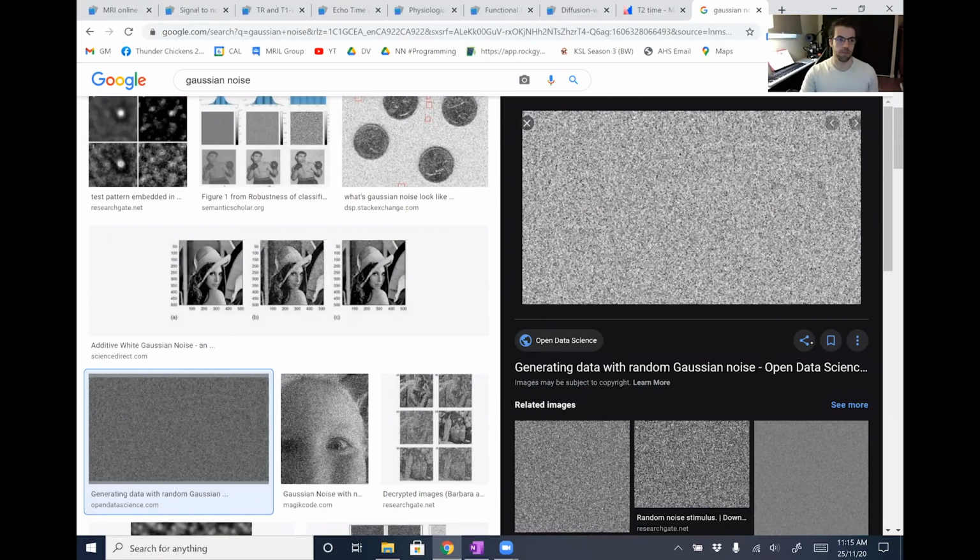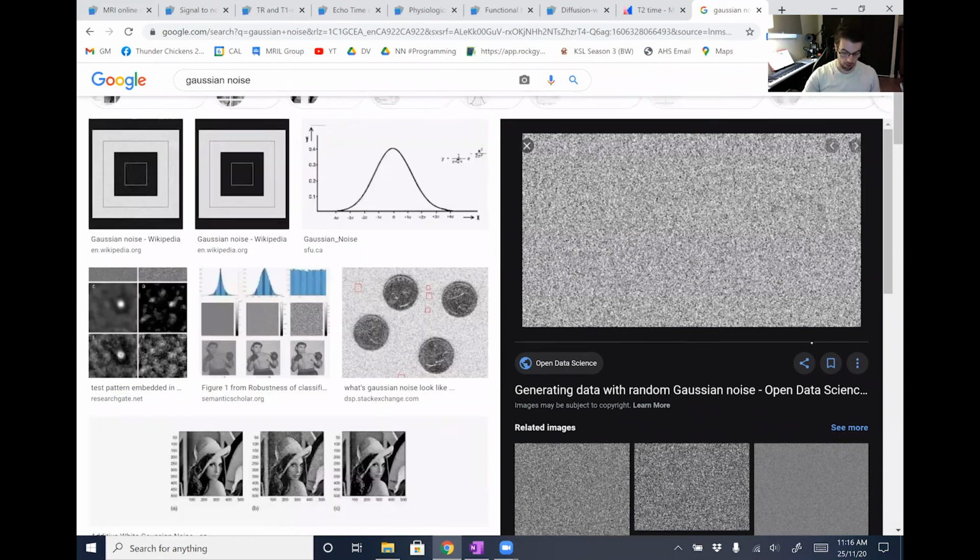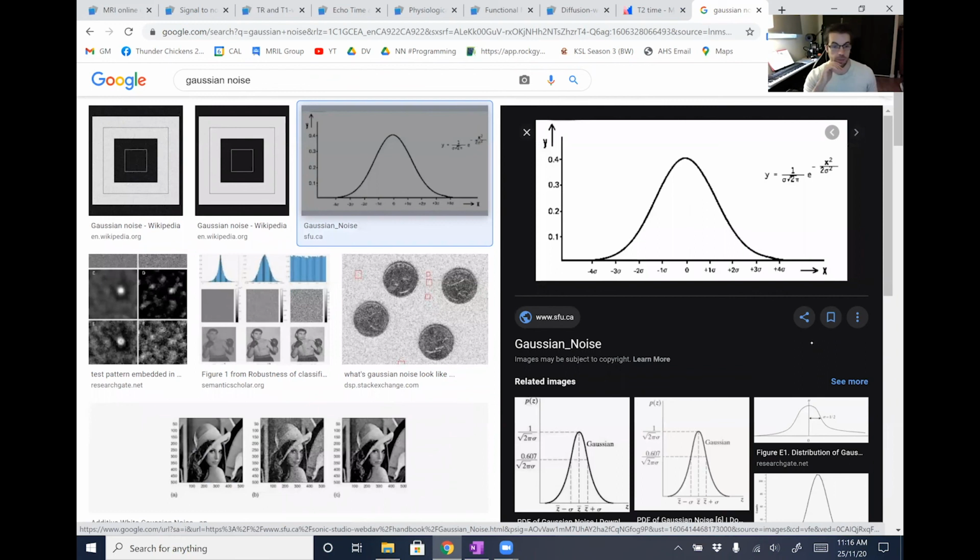All right, so coming back, recording is started again. I just wanted to address the question of noise in MRI being defined as white additive Gaussian. Over the break, I looked it up and have a better idea of what exactly that means. For those unaware, like myself previously, this is a model of noise. The Gaussian distribution is the normal distribution, which I think is on this page somewhere. Something like this, which essentially means that across a sample there's a mean, generally 0, and the likelihood of something above or below that mean is equal. And that describes noise in MRI quite well.